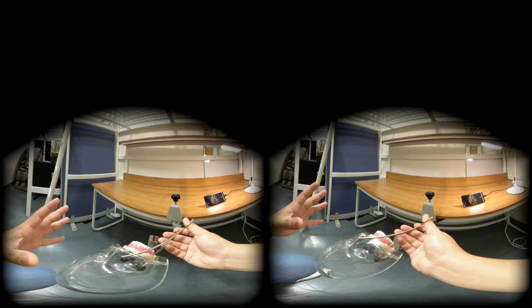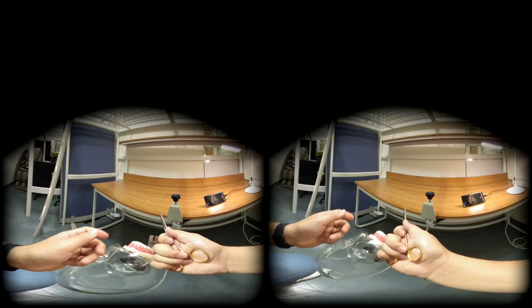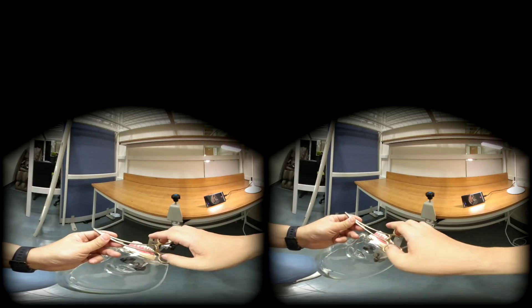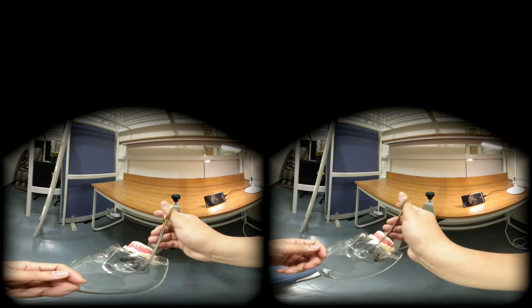Of course, I also use the tripod grip, palm grip, or pan grip sometimes. But 90% of surgeries, I do this reverse grip. So this is the reverse grip.